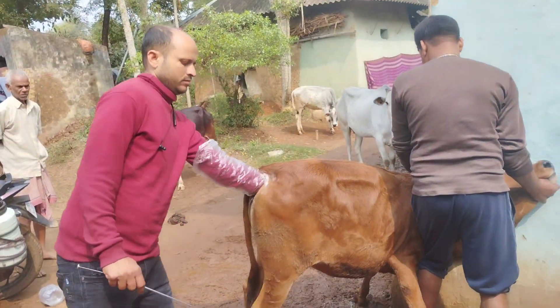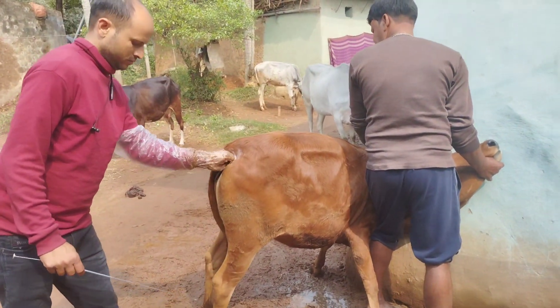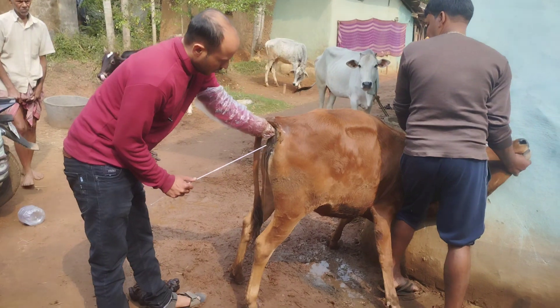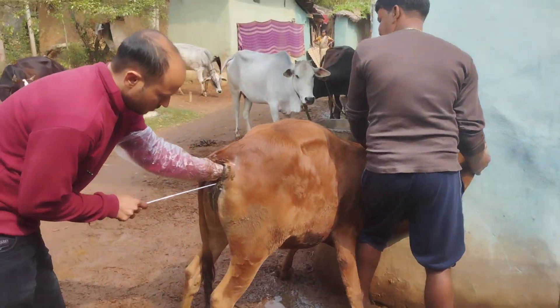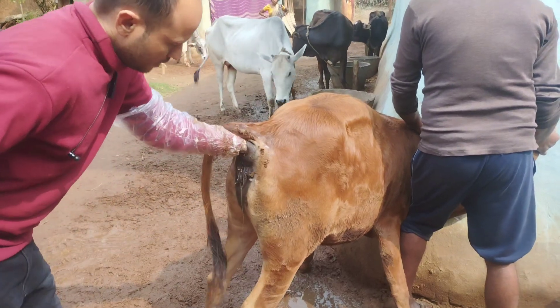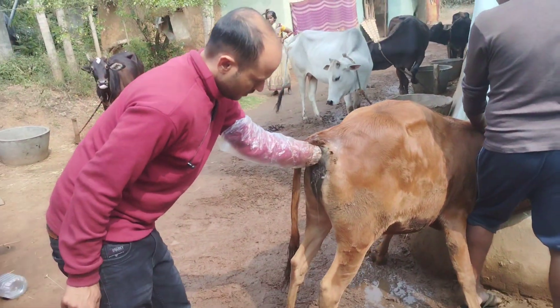Then another person should be positioned at the head of the animal. We are going to show you what it looks like.